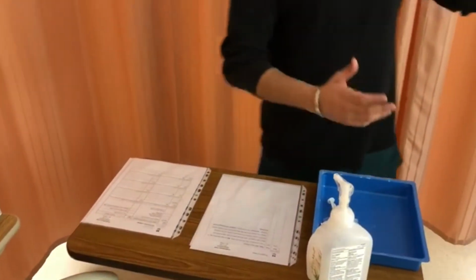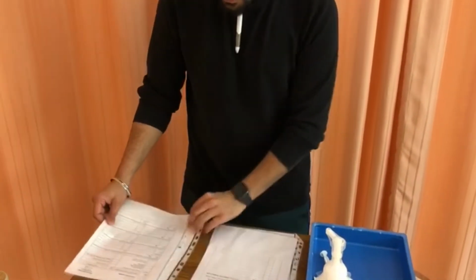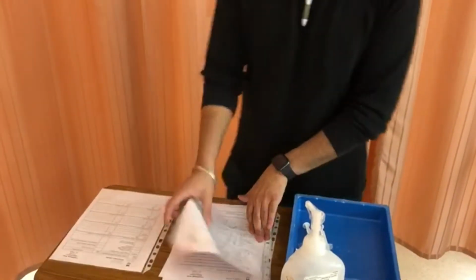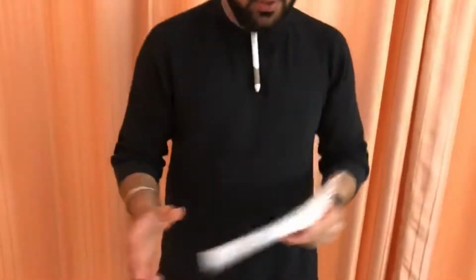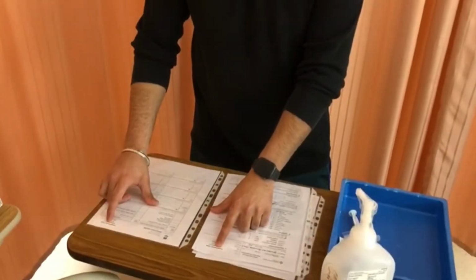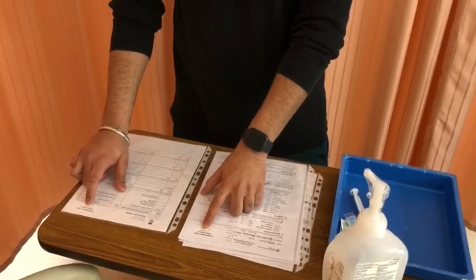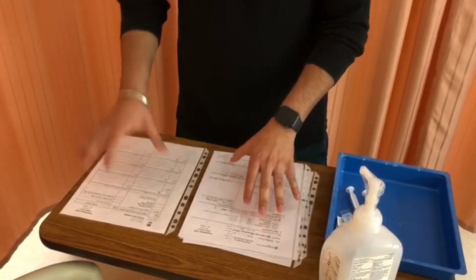Now we can verify the TPN. So there's a requisition for the TPN. This is the requisition here. And this pretty much tells us everything that we need to have in our TPN in order for it to do whatever it needs to do for the patient. So we can first compare this to the MAR. We have the right patient, so Fred Fredrickson, MRN 0990127, 37 years old, under Dr. Ames. This is our requisition, this is our physician's order.